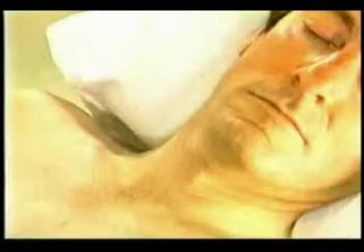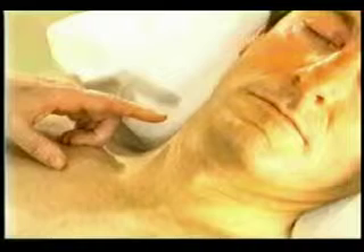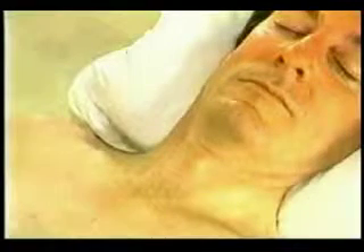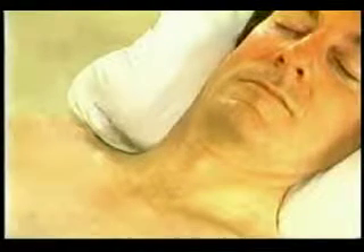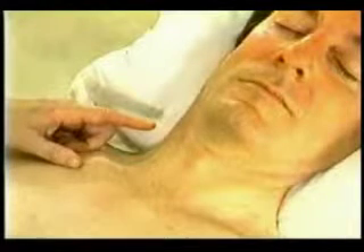Another challenge is represented by masses under the sternocleidomastoid muscle. These may be large, causing the muscle to bulge, or small and difficult to detect under the muscle. In both cases, it is wise to avoid penetrating the muscle in order to sample the mass.